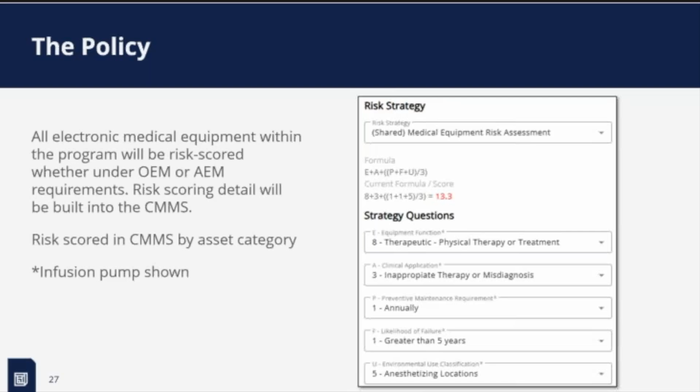And if you need to go to the asset level, these particular assets are in this department, and these ones are in a less risky department. That might affect your strategy as well. Then you build the formula, the mathematical equation, and it comes up with a risk score. A lot of people have done this on spreadsheets, writing the formula in Excel and applying that number.